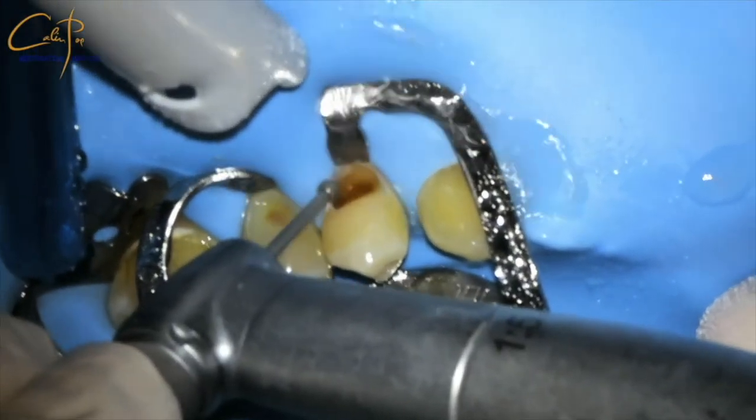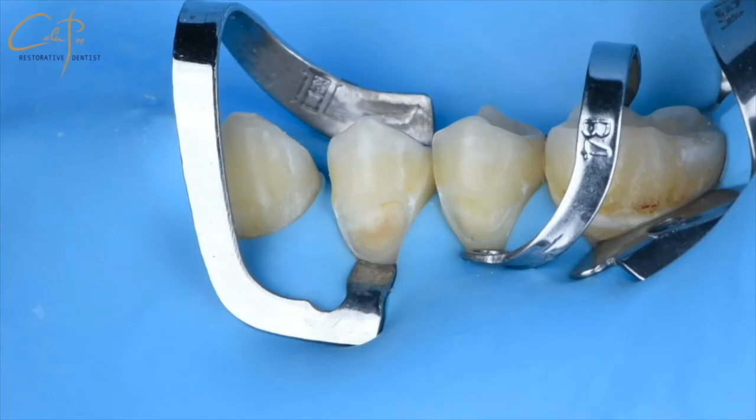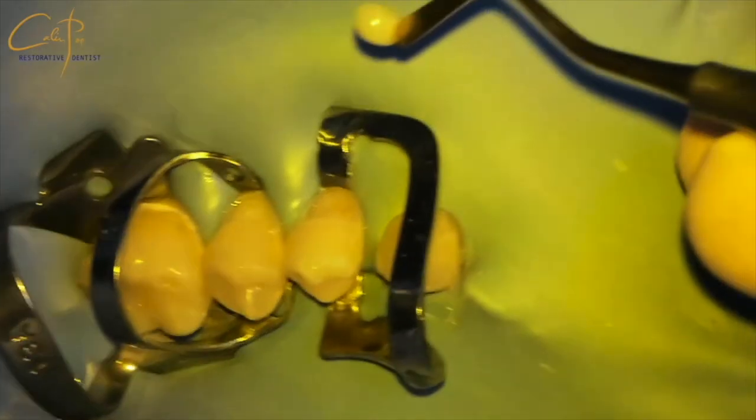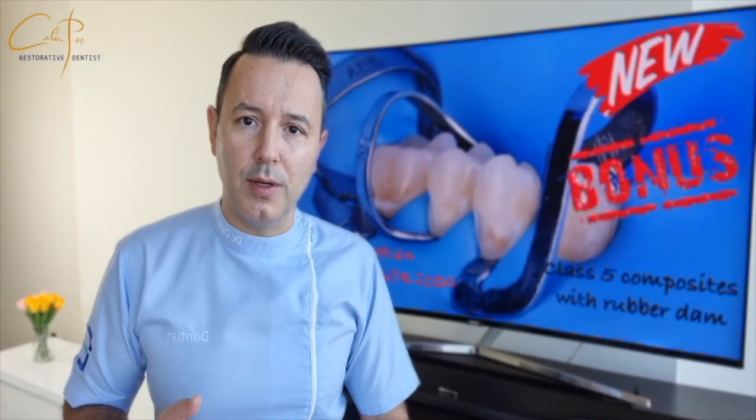We need to retract the cheek and the tongue to obtain space so we can have enough light and visual access to be able to perform the preparation of the cavities in optimal conditions, and later on to be able to layer the composites relaxed, without the permanent fear that saliva will invade your working area.